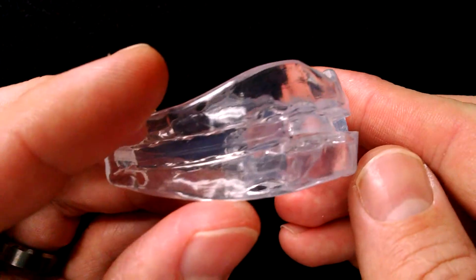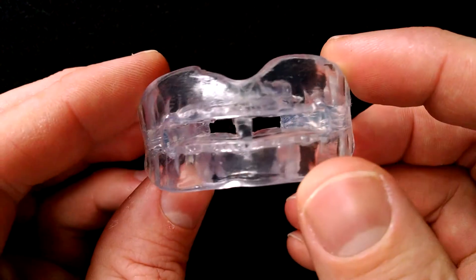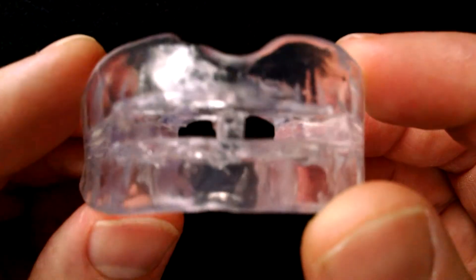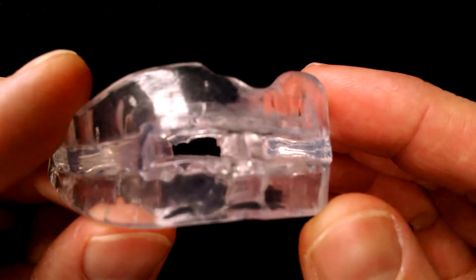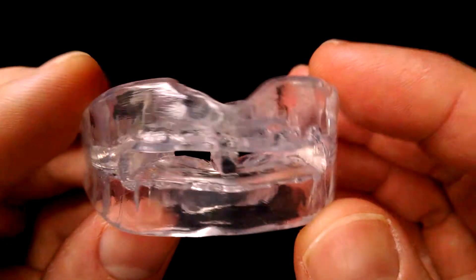The first thing you can notice about the Rip Snore is the fact that it has two fairly large air holes here at the front. So that's good if you're a mouth breather.